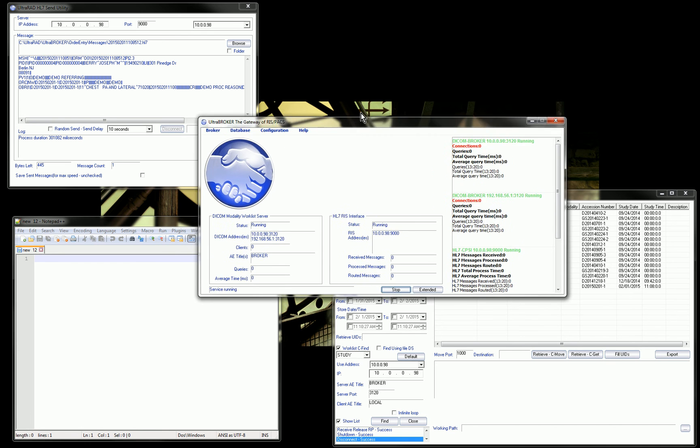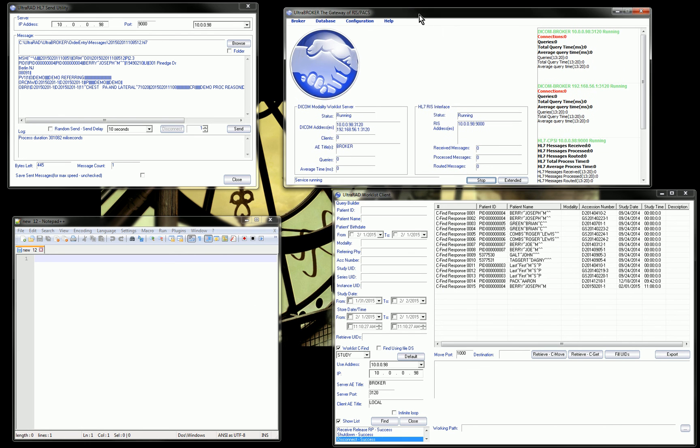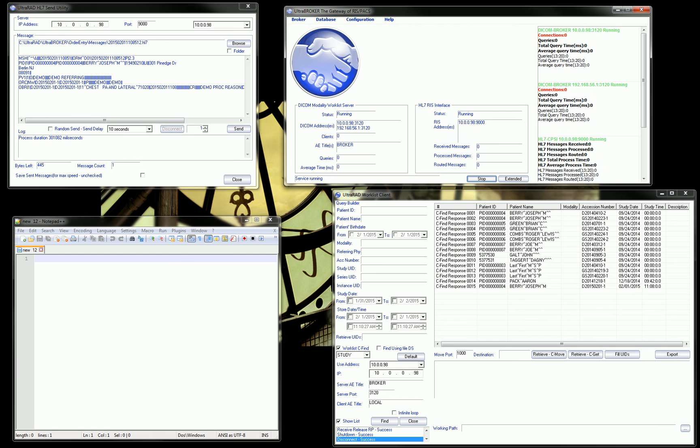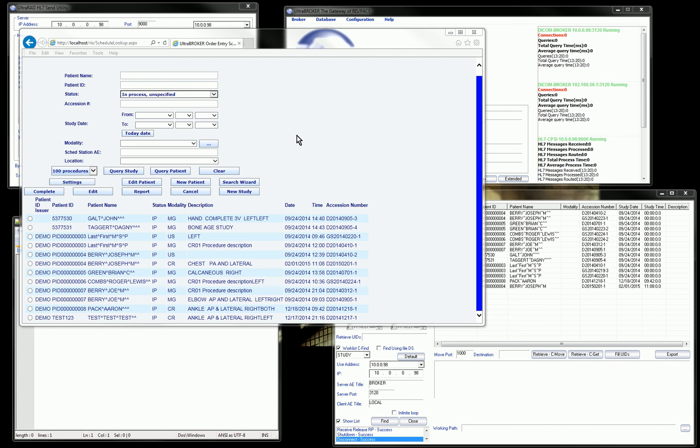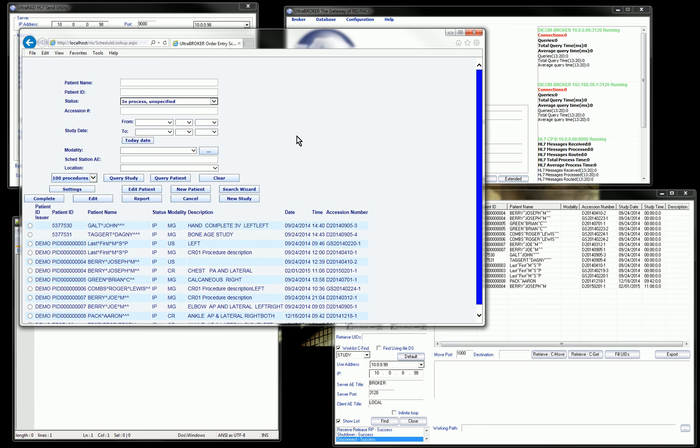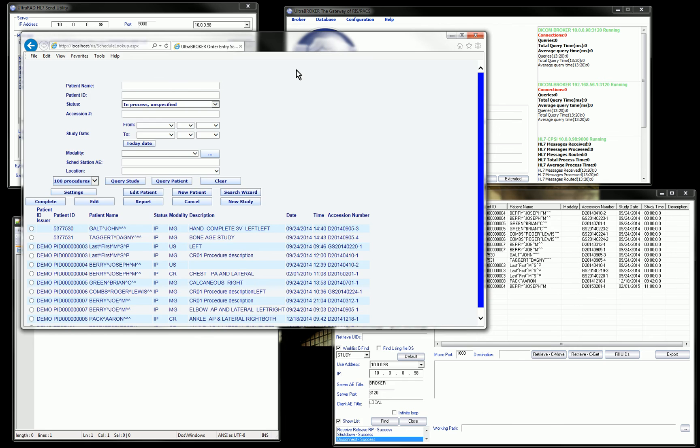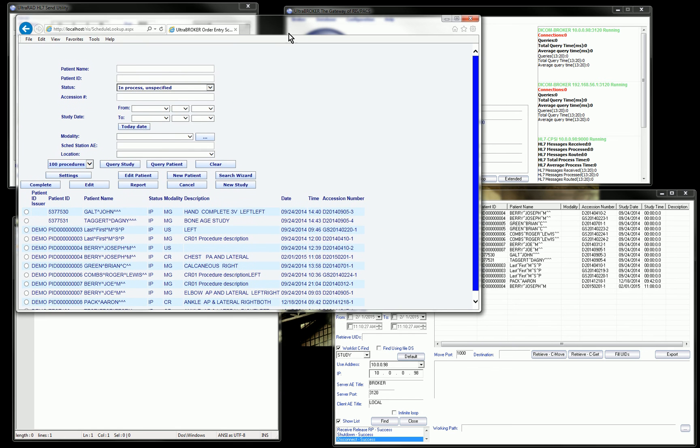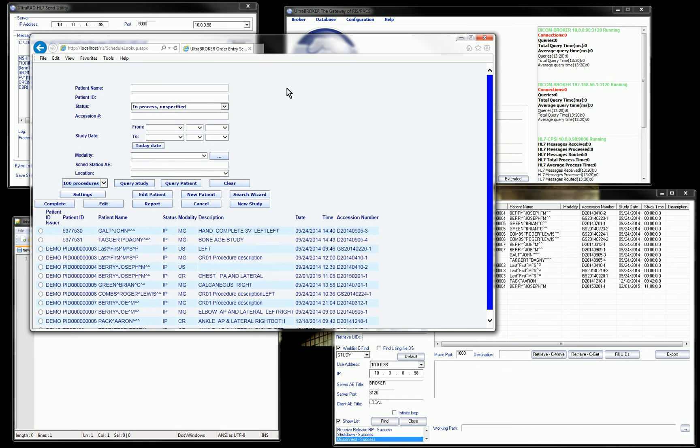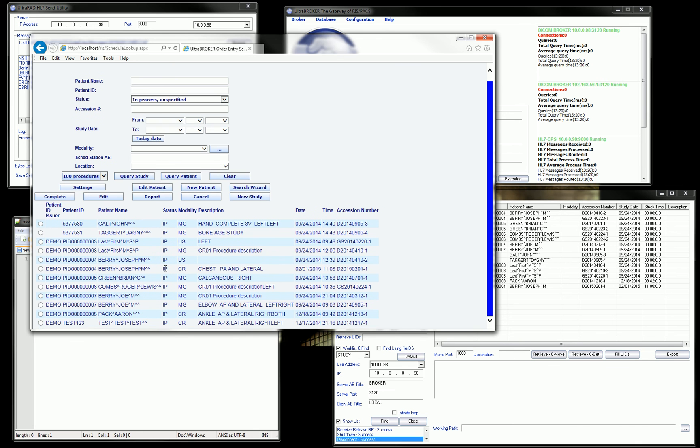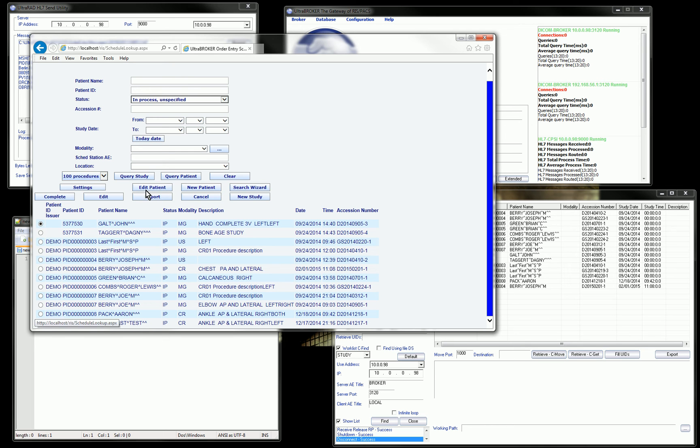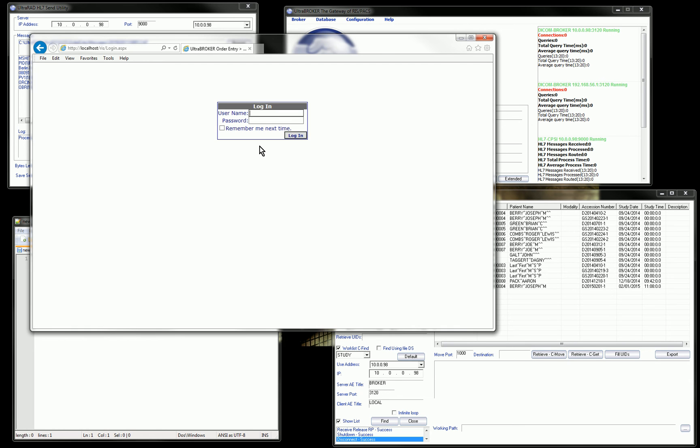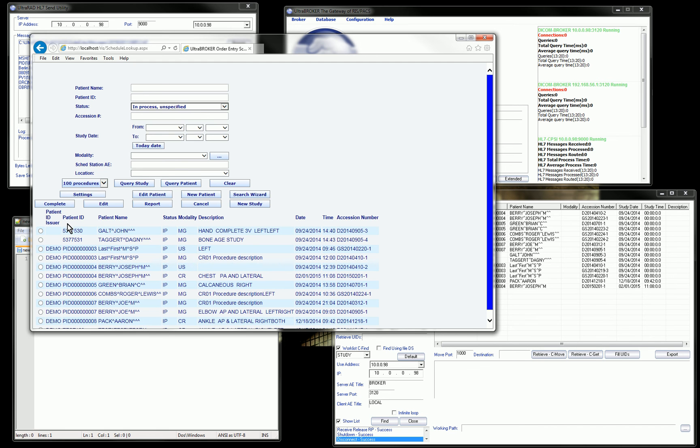As an example, what I did here is I have a fake RIS that we can use to place an order. Here's my RIS over here. This is not really a core part of the product, we just have a fake RIS here we can use. Obviously, for a demo, I don't have a real RIS laying around. But this would represent some kind of information system. Let's say I want to put in a new order for my patient John Galt. I'm going to select that patient, new study.